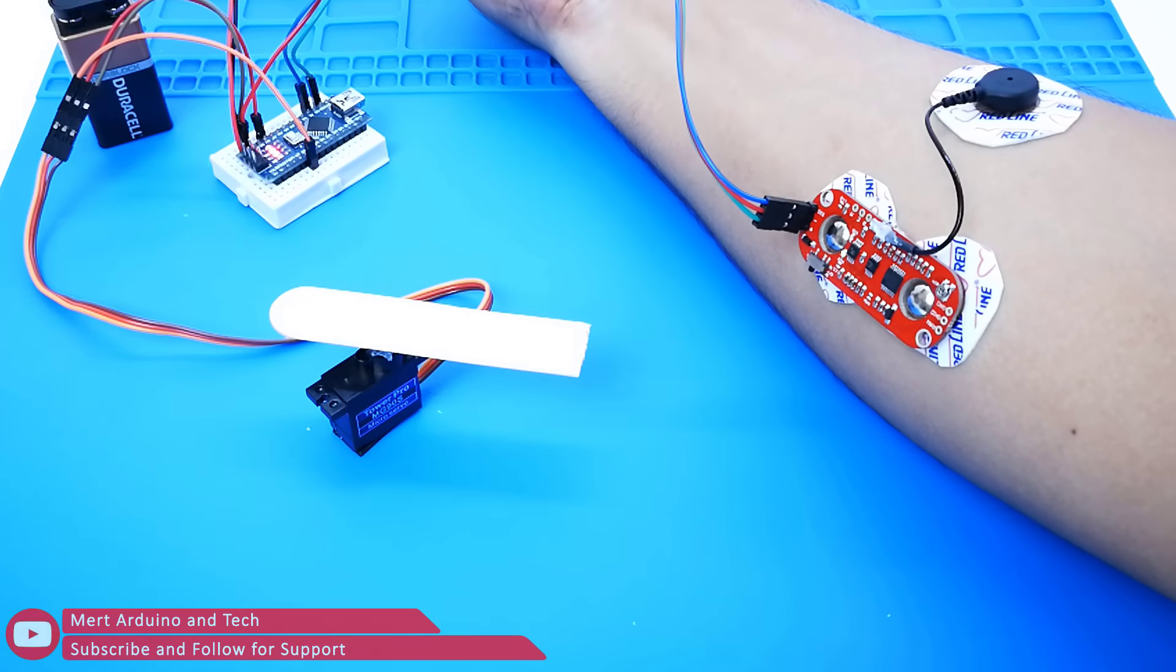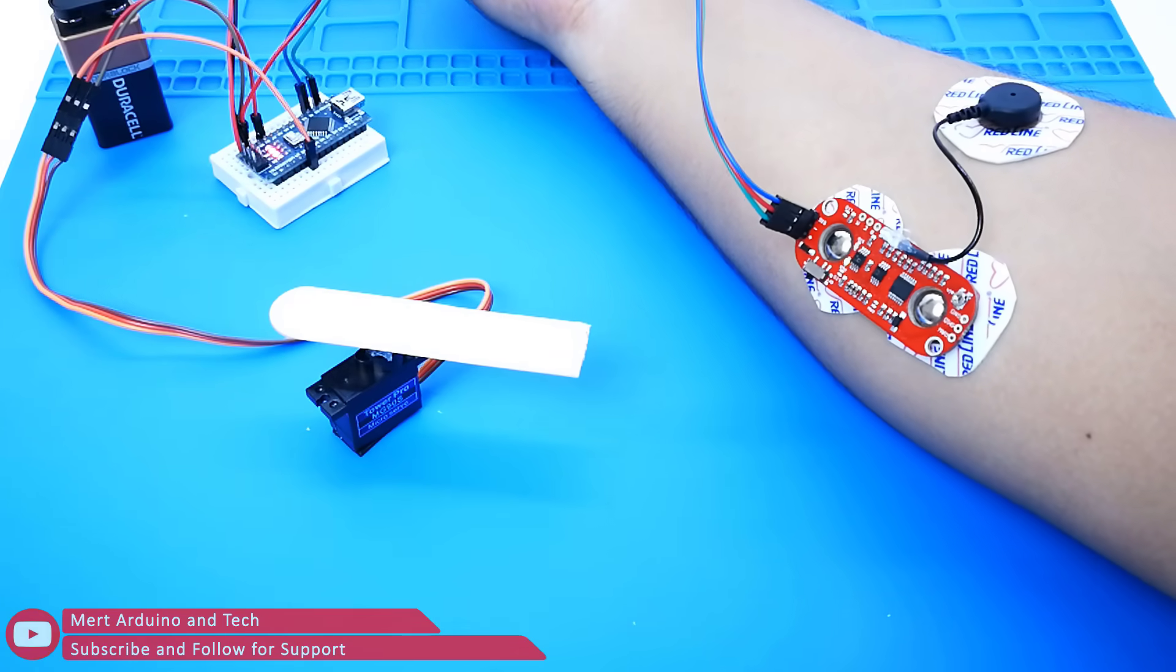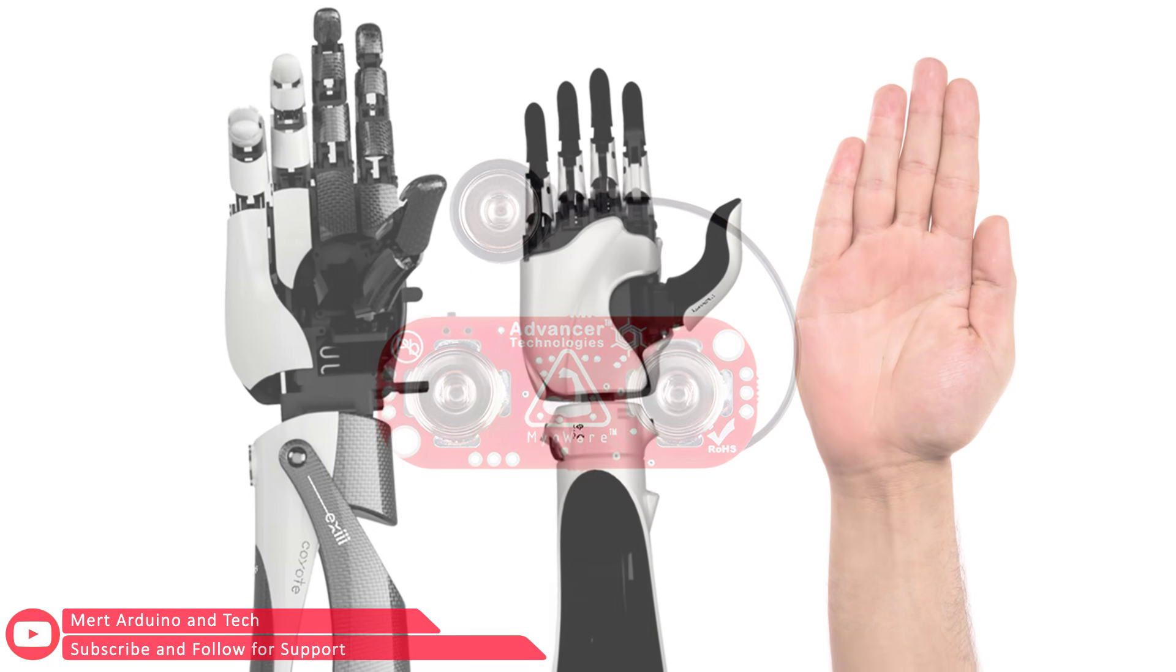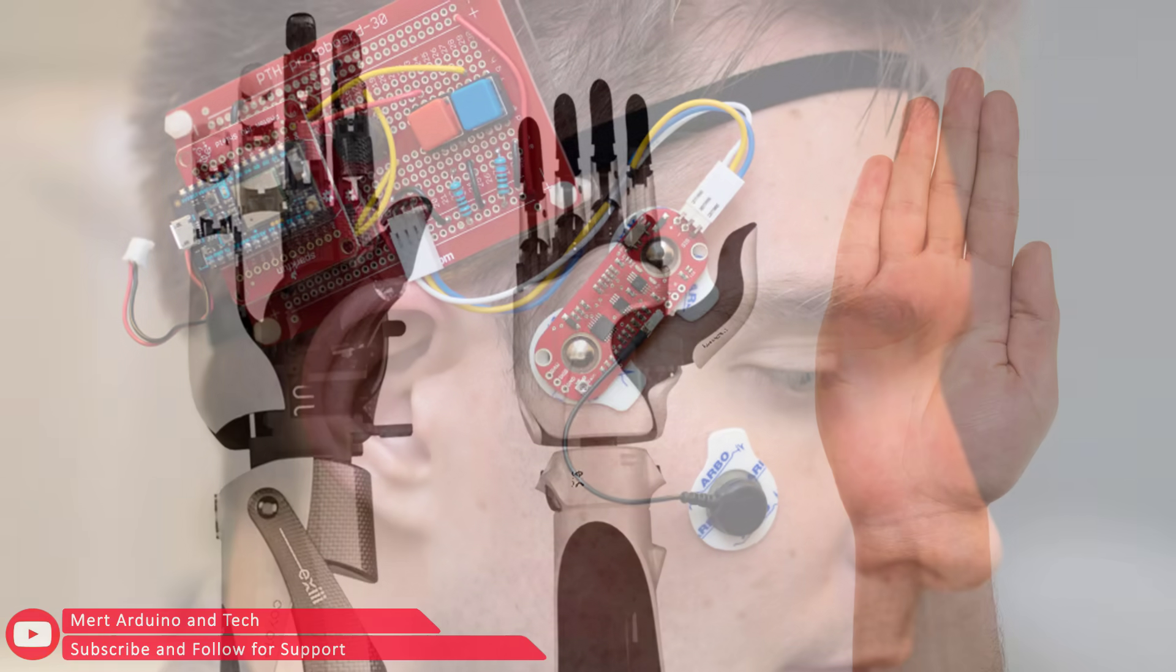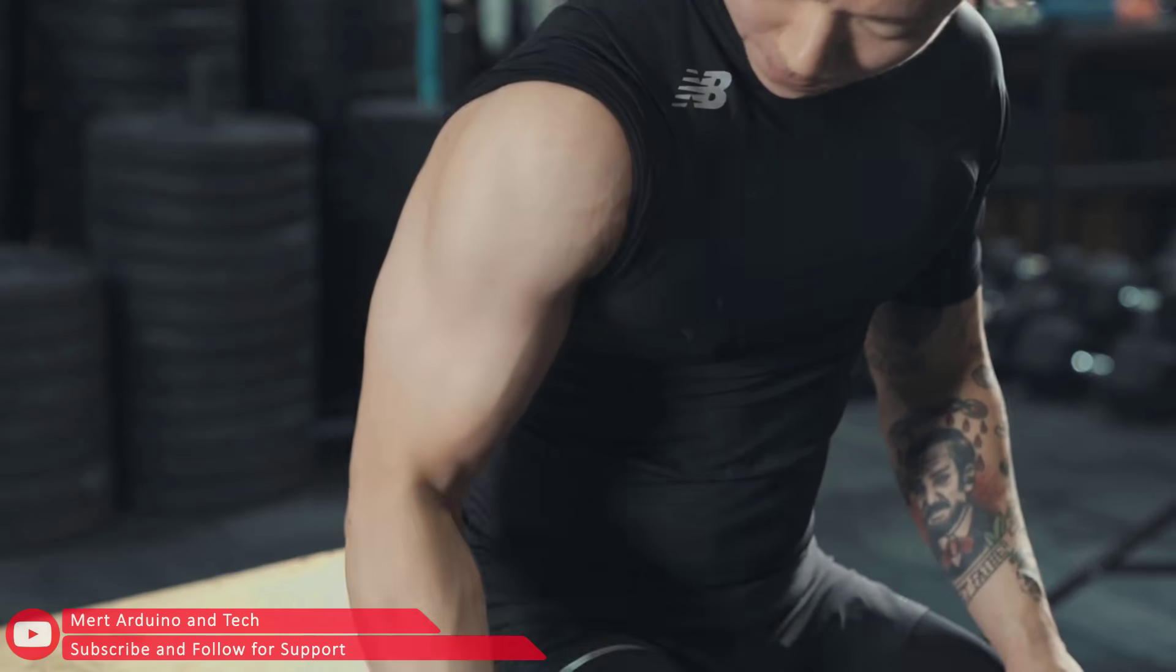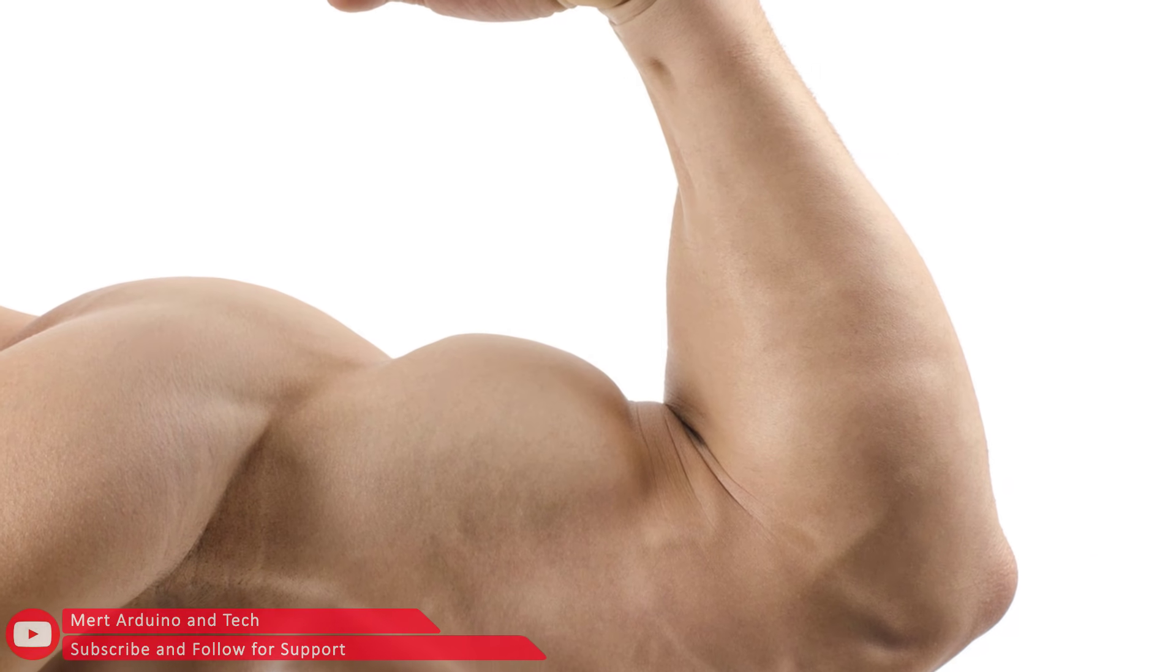Hi everybody, today we will learn how to use the MioWare muscle sensor and control a servo motor. So with this sensor you can control a robotic hand, or you can use your muscles to control anything. Using our muscles to control things is the way that most of us are accustomed to doing it.